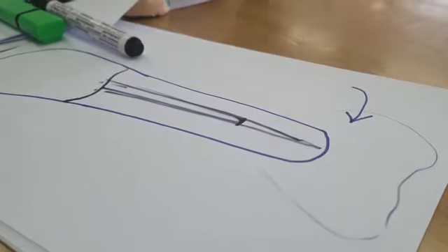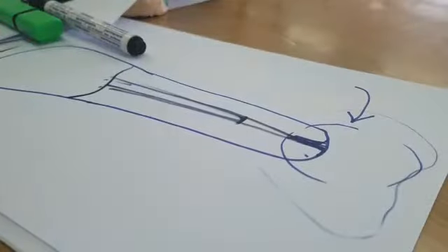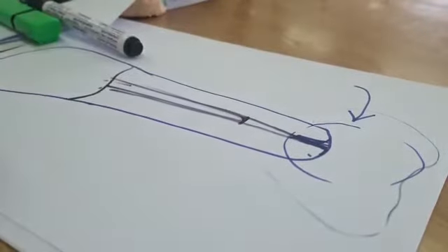Apicoectomy will go from the alveolar bone, cut it, open a window here, and they will begin cleaning and reshaping and putting MTA or whatever sealer they're going to place. They're no longer depending on the gutta-percha because they could not place gutta-percha back into this, backwards. So they're placing another material that produces the best seal, and MTA is known for apicoectomies. Okay? So this is apicoectomy. Don't disrupt all of this to treat endodontic lesions, if it was well designed. But if it has a problem, yes, why not?